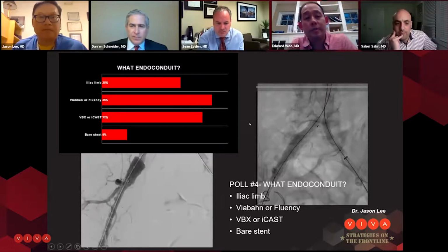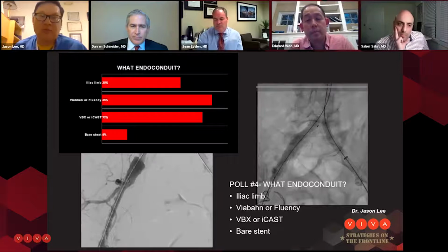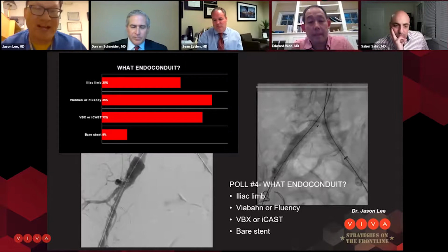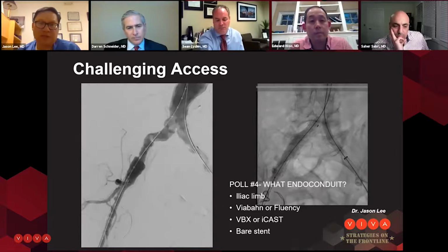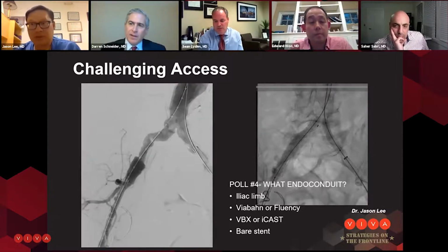Jason, what size limb do you use, just for the audience? So all of the proximal parts are 16. Remember that when you're using the IBE limb, it's flipped then, right? So proximally, you can choose a 16, a 14 and a half, or 12, and then distally it's 16 down there. This whole thing measured about 8 or 9, so it is quite a bit of oversizing, but in my experience, the iliac limbs can be oversized, and they don't wrinkle like a Viabahn can wrinkle and create a little divot, if you will, that can get thrombus in it. I don't know what other people's experience is with oversizing a Gore iliac limb. I've had pretty good results with it, like severe oversizing.